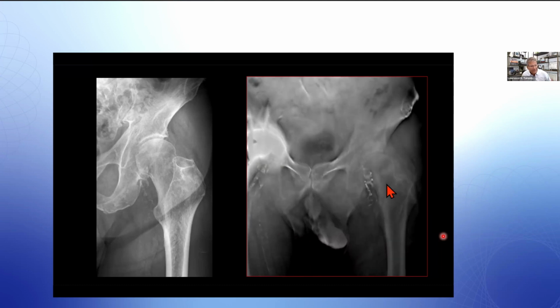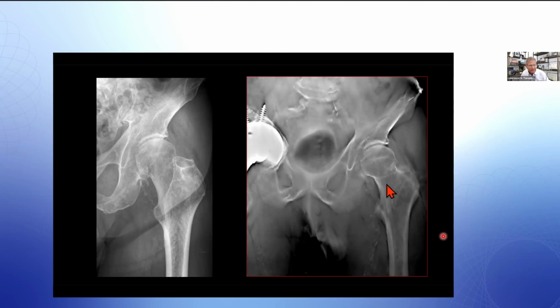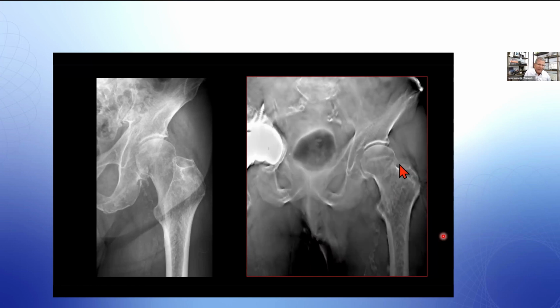Essentially comes out in a series, depending on where you are in the anatomy going front to back, you will see a different part of the exam in focus, and eventually you can see exactly what you need to see here, clearly going beyond the x-ray.